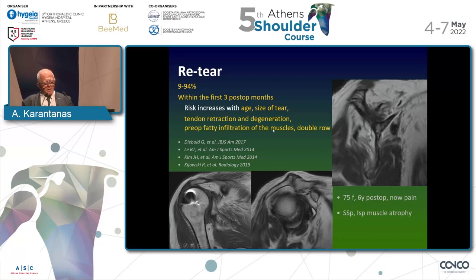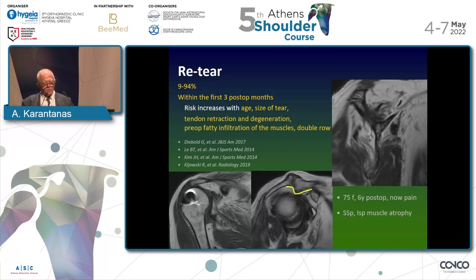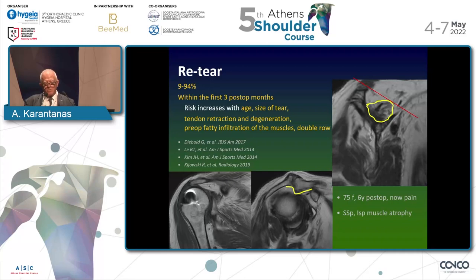What we do in our report is to particularly address fatty infiltration of the muscles. For instance, this 75-year-old lady six years after operation has pain. The distance between the humeral head and the acromion is almost zero. Unfortunately, there was no subacromial decompression, and there are lots of osteophytes projecting under the acromion — perhaps the cause of retear. Using the tangent line method, the supraspinatus shows fatty infiltration grade 2-3, and the infraspinatus is grade 4. Usually in these patients we don't have very good results.